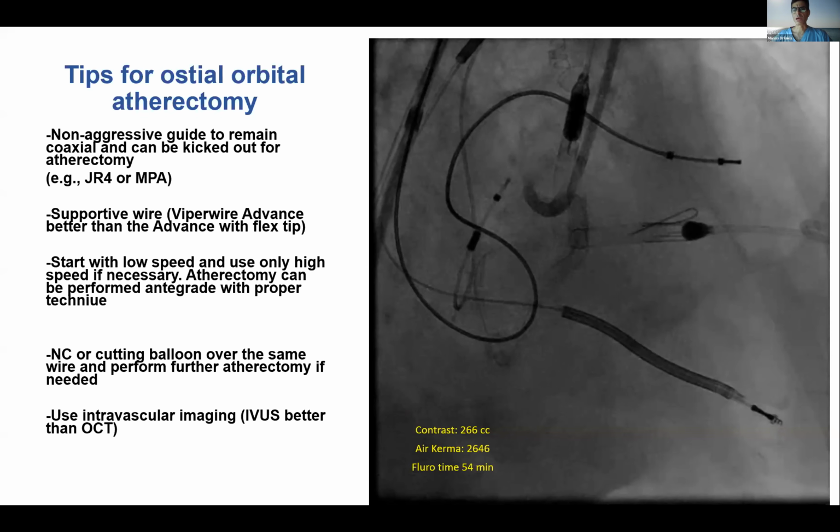And then another question that came is about doing sequential intravascular lithotripsy, and has anyone tried kissing intravascular lithotripsy? So I don't know, Lindsey, Michael, have you used much intravascular lithotripsy yet? I know it's a fairly new system, and there have been some financial challenges with using it, but how has been your experience with this if you've used the system so far?